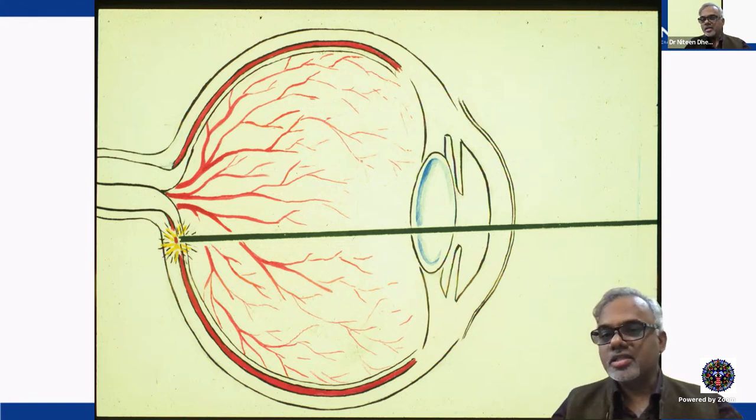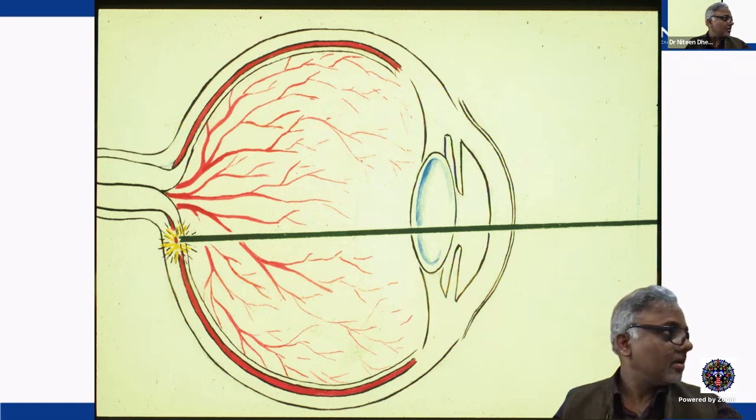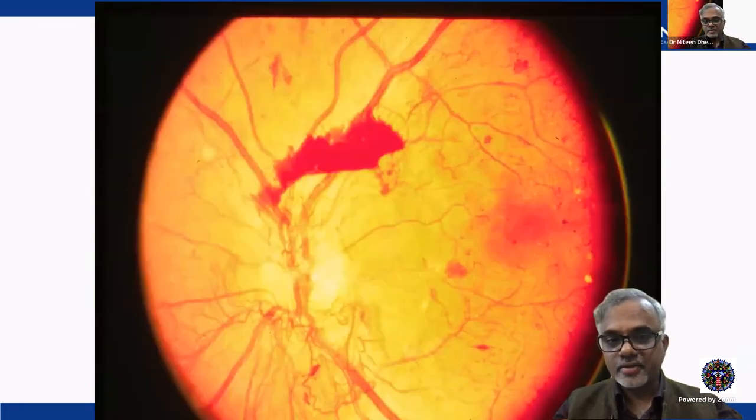Here, they are selectively targeting the corneal tissue and slicing it, and over here it selectively targets the vessels. This selectivity comes through selective photothermolysis, by adjusting the wavelength, the exposure duration, the spot size, and the other parameters. So this is the magic of selectivity.